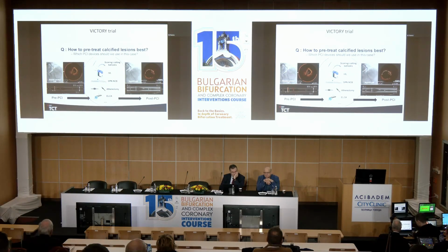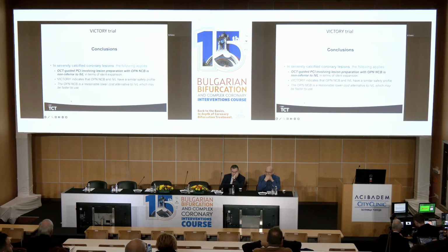And we also have the VICTORY study published at TCT, a comparison with the OPN balloon. Probably everybody in your center has this balloon available. It was a comparison of IVL versus OPN balloon, and you see there was non-inferiority for OPN.